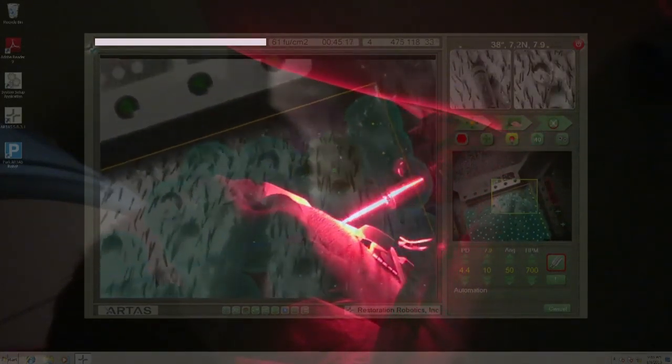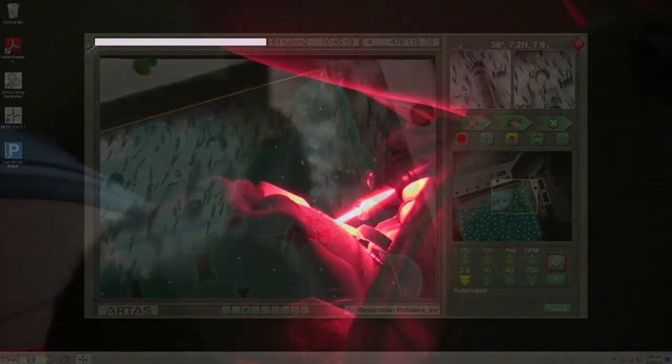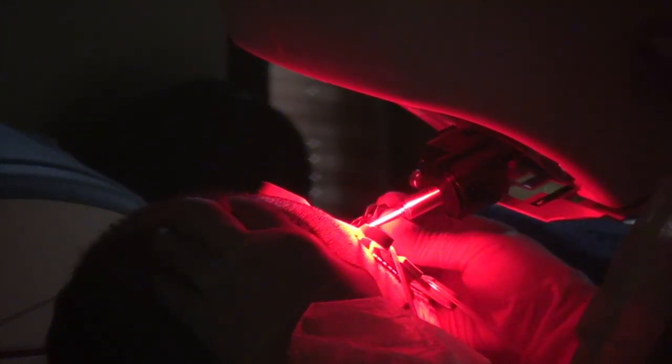We do a bunch of different cosmetic procedures, and one of these devices that comes with heating the surface of the skin is a laser thermometer. You basically point it and shoot it, and you can tell how cold the solution is. So we do that routinely throughout the case, and we record those temperature readings just to have proof of what we're doing.